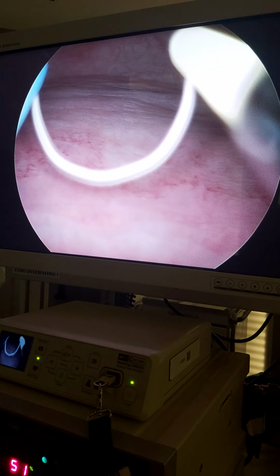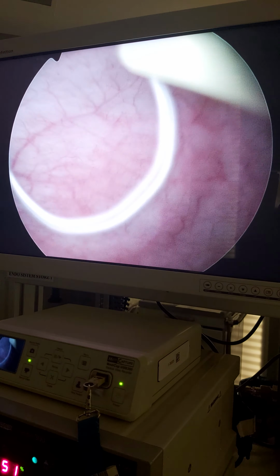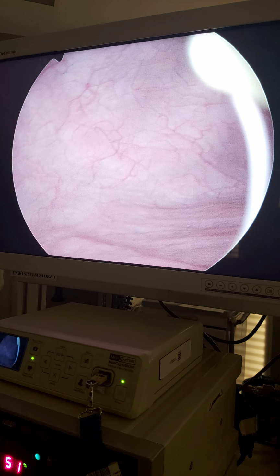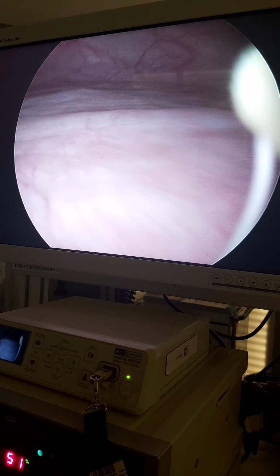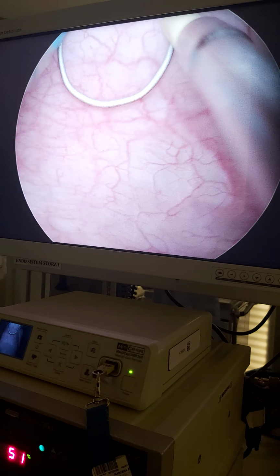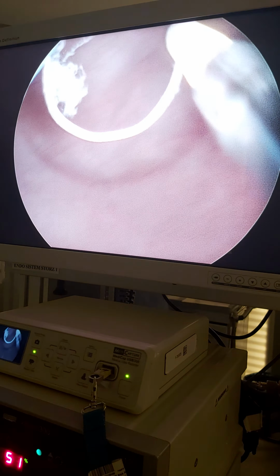So we will mark our leukoplakia lesions now, and keep an eye on the bladder. Okay, this is inflamed here. I will make a little fulguration there. I hope the rest of the bladder will be healthy. Just not to forget, I am putting a mark here. Here. The rest seems quite healthy. I wish it does not bleed.